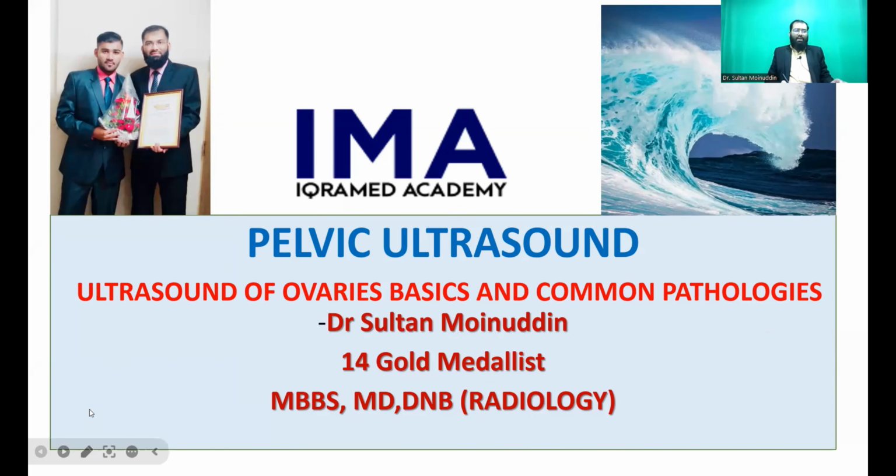Yesterday we had discussed ultrasound of the pelvis, right? We discussed how we take images of the uterus. We also discussed some important pathologies of the uterus. Today in this session we'll be seeing about ovaries.